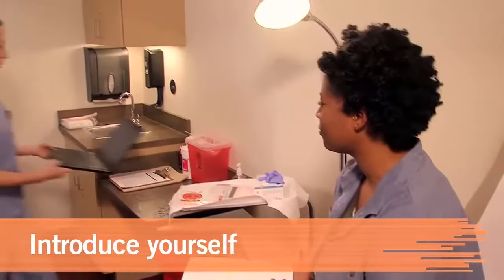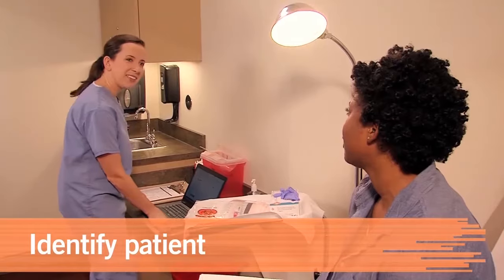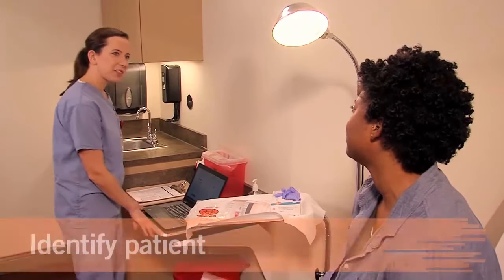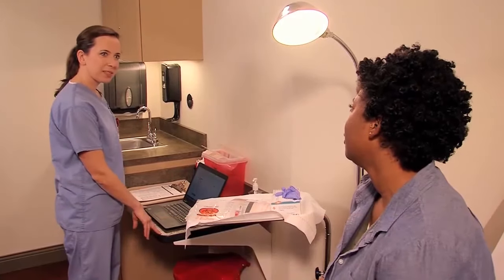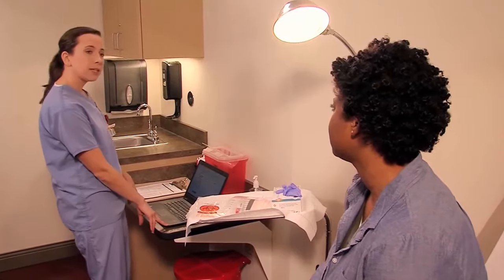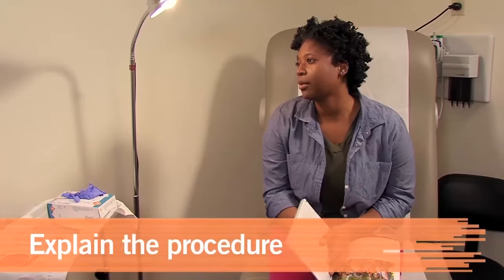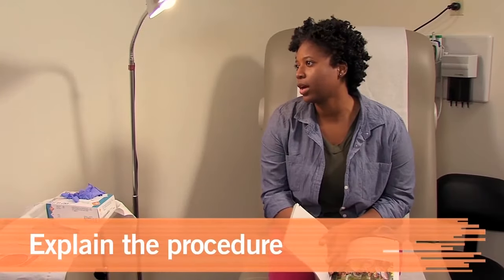Introduce yourself and identify your patient using two identifiers. 'I'm the medical assistant today.' 'Nice to meet you.' 'Can you confirm your name and date of birth for me?' 'It's Candice Rogers.' Then explain the procedure.